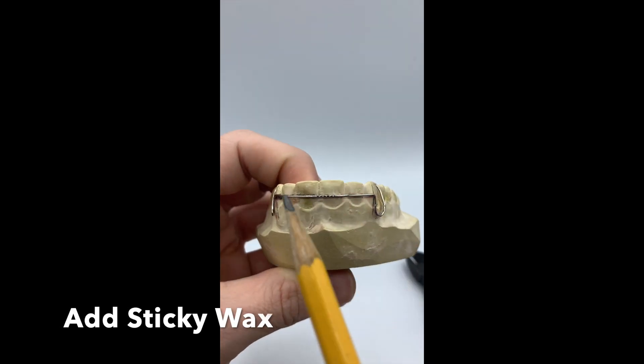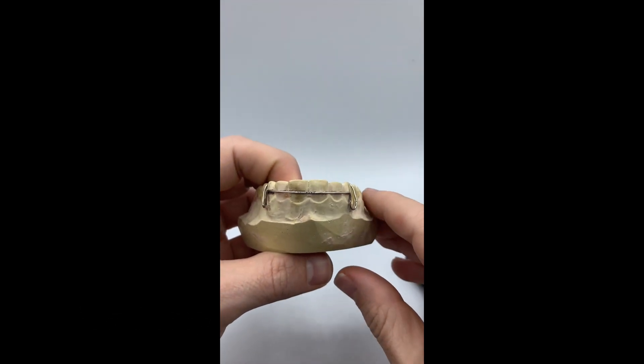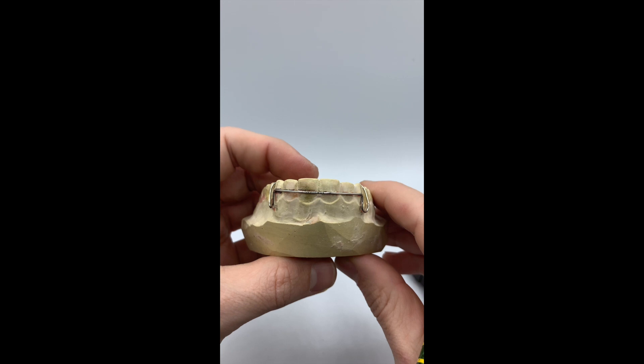Seal your wire in place. You want to add sticky wax to the labial surface, cuspid loops and between the centrals. We want to twist it.